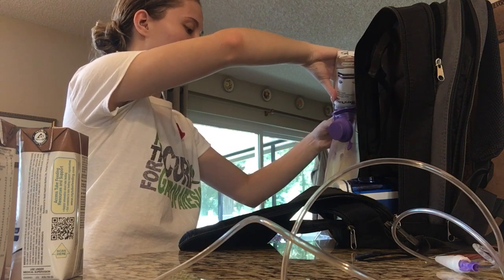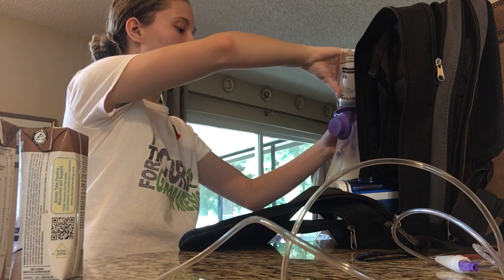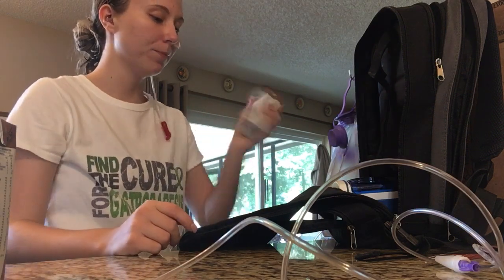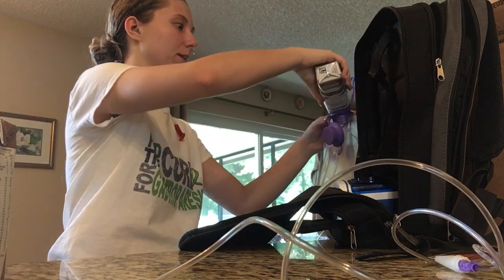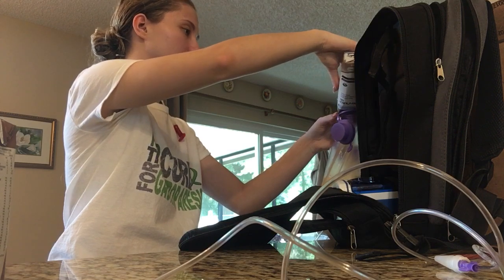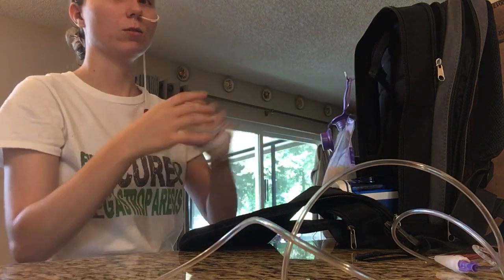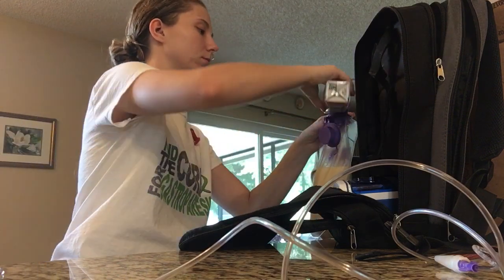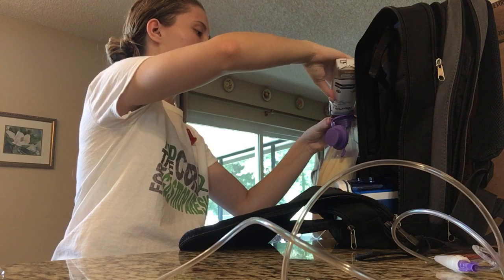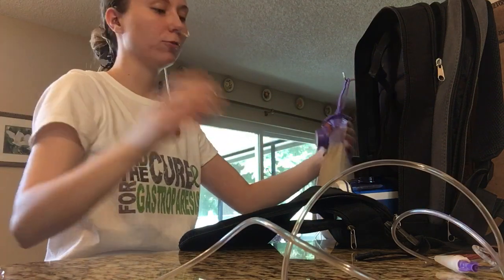I store my formula at room temperature, and then if I'm going out in the heat for any reason, I put an ice pack in my backpack to keep my formula cool. That way it doesn't go bad, because I have had that happen, and trust me, it is disgusting. It's basically like bad milk. Right, almost done with this. All right, now I have all my formula in there.